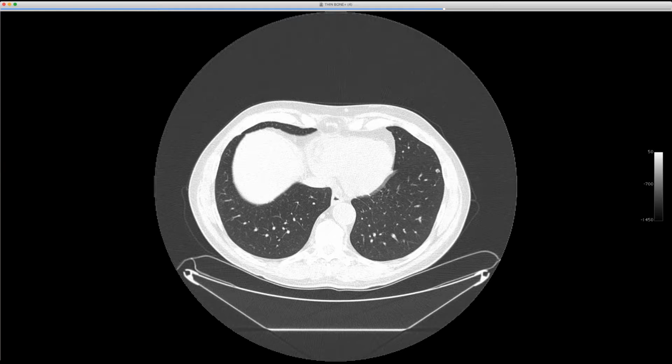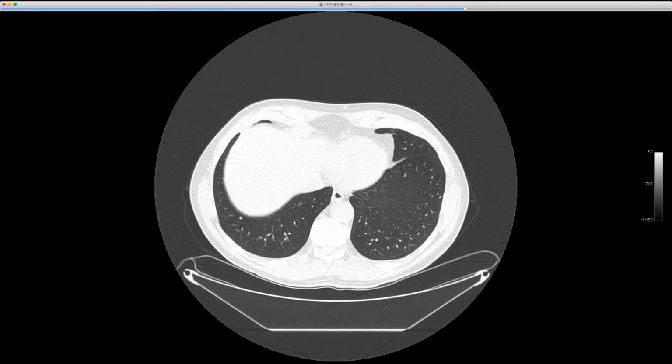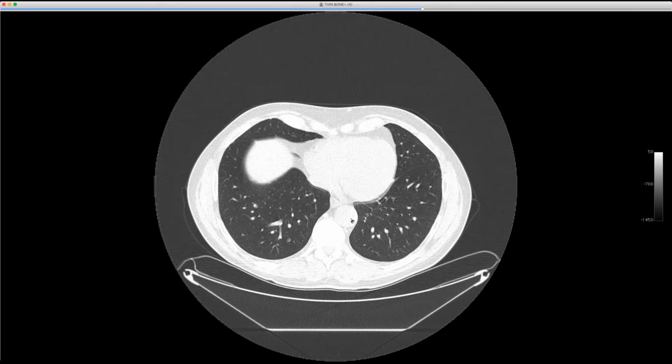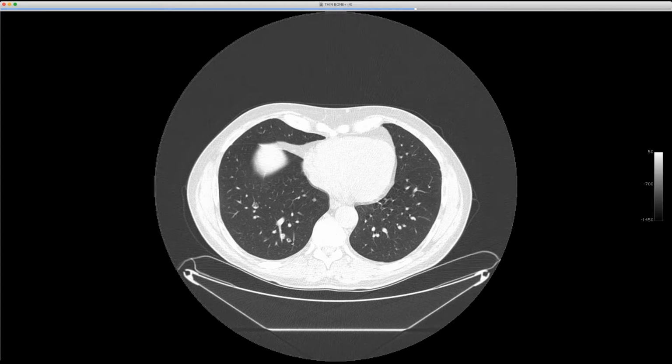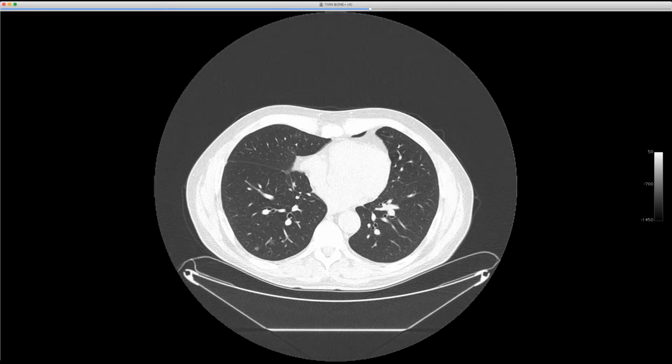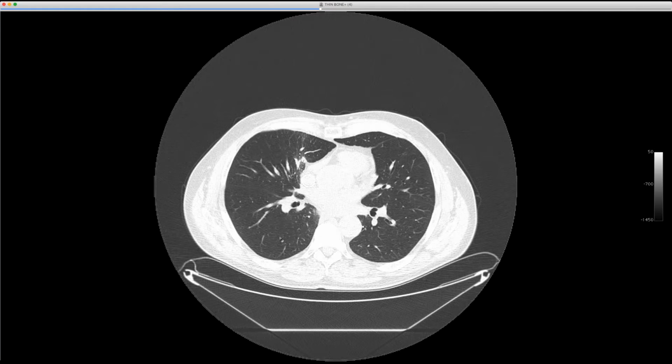Unfortunately, I didn't dig out the exact pathology subtype of it. So it's possible there was a thymic adenocarcinoma, which would explain the Cheerio appearance. But as far as I know, it wasn't a weird mucinous variant or something. But I've never seen thymic carcinoma mets look like this. We see this more with colon and lung. But add this to your list of Cheerios.